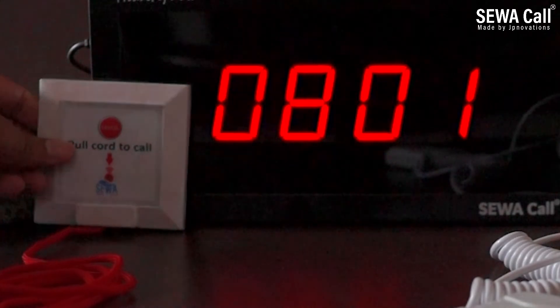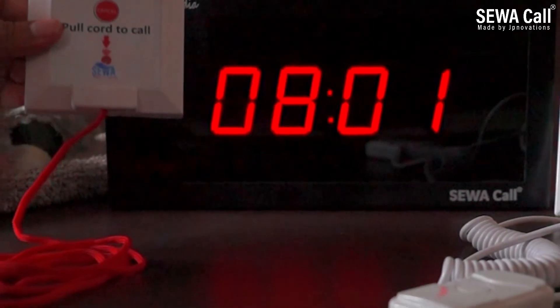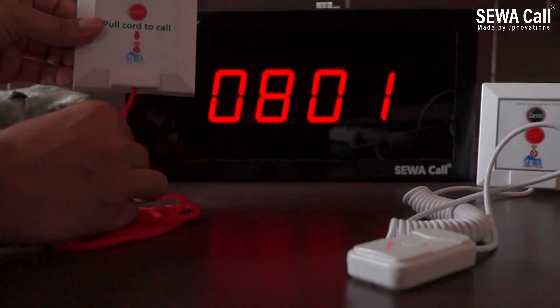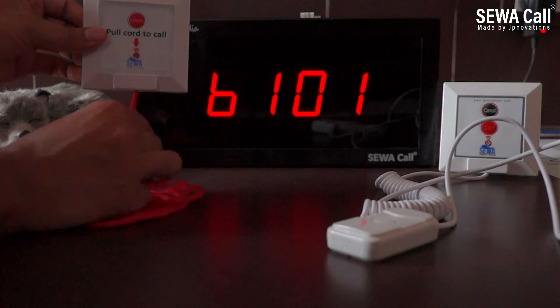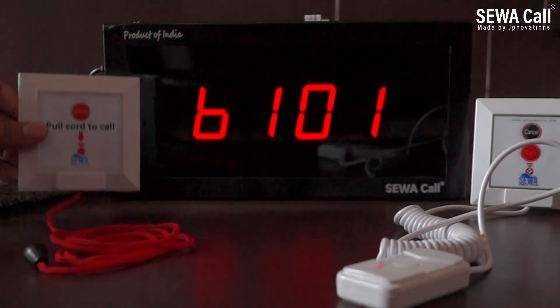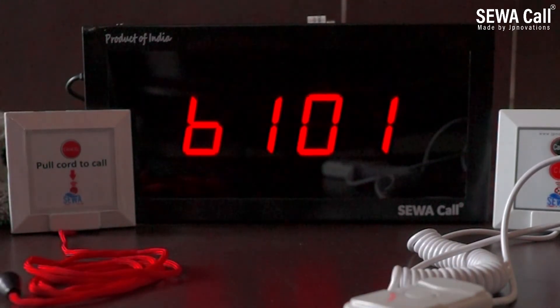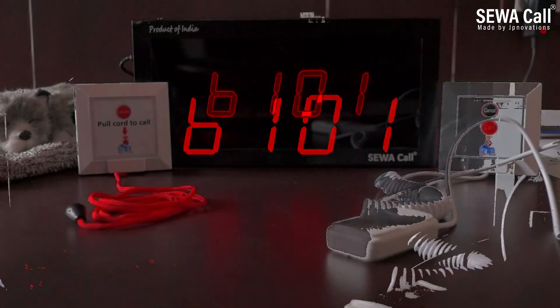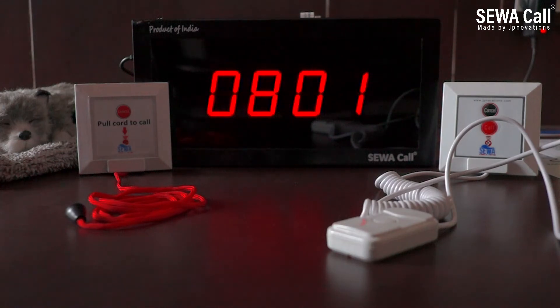And this is the washroom unit, for use in case of emergency situations at washrooms and toilets. The patient can pull the cord in case of dizziness or any emergency, and the number will display on the nurse panel. For example, here it is showing B101 is calling — B here denotes bathroom. As soon as the nurse presses cancel, the number gets removed from the nurse panel.